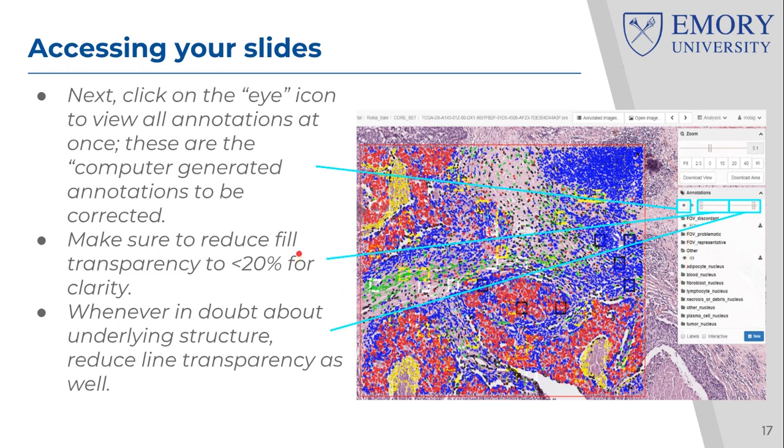Now, one thing you need to do, for your own convenience and for making sure that you make accurate annotations, is go to the slider bar on the left here and reduce it almost to the minimum. If not to 0, then maybe to 10 or 20%. This reduces the transparency of these computer-generated annotations so that you can see the underlying tissue. You can really see what is going on under these colors. And that turns out to be important, as you will see in the tutorial later on, as I zoom in on some of these snapshots, okay?